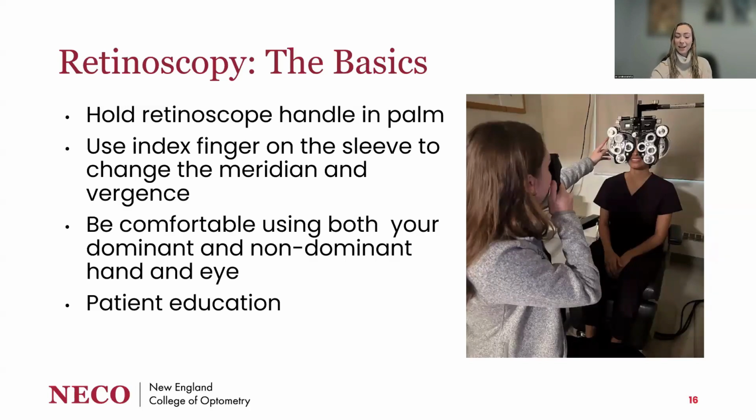My patient education here is that I'm going to be using my instrument to get an estimate of your glasses prescription. Please look at the letter behind me. Try to relax your eyes and let me know if I block you at any point in time.